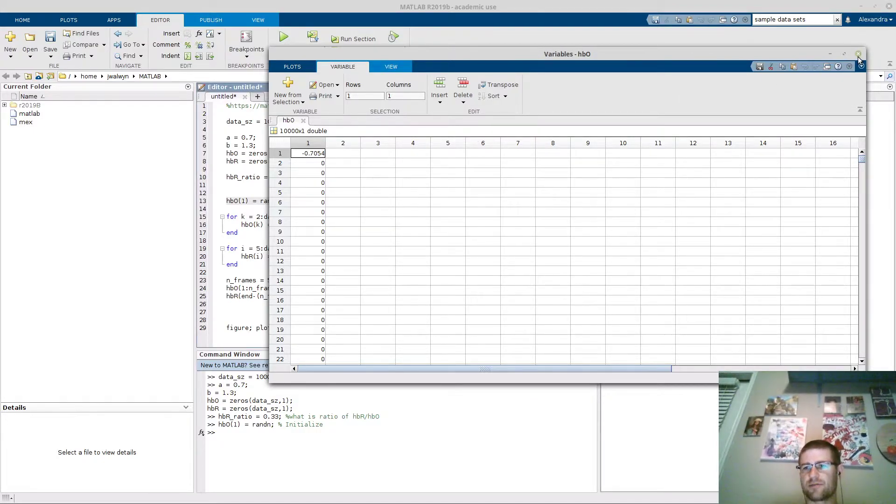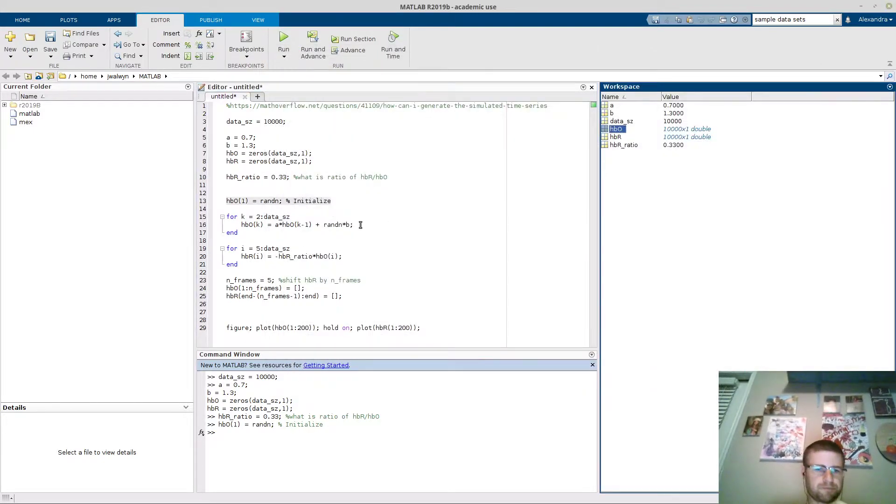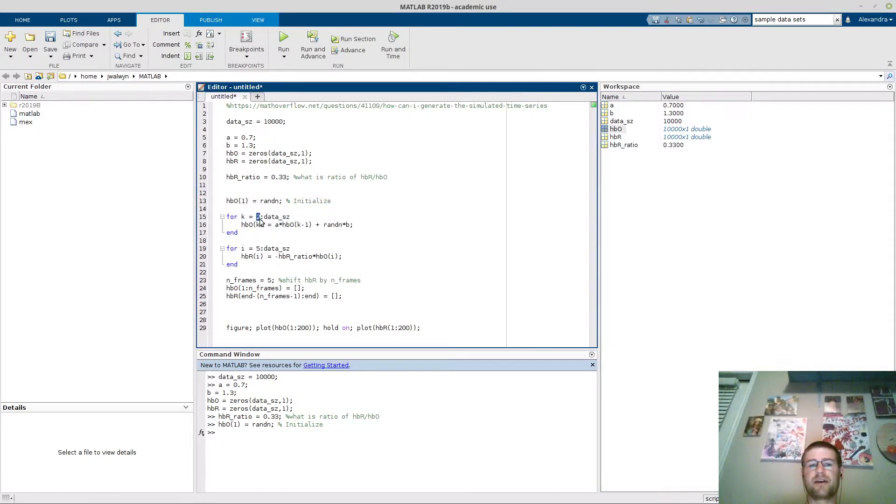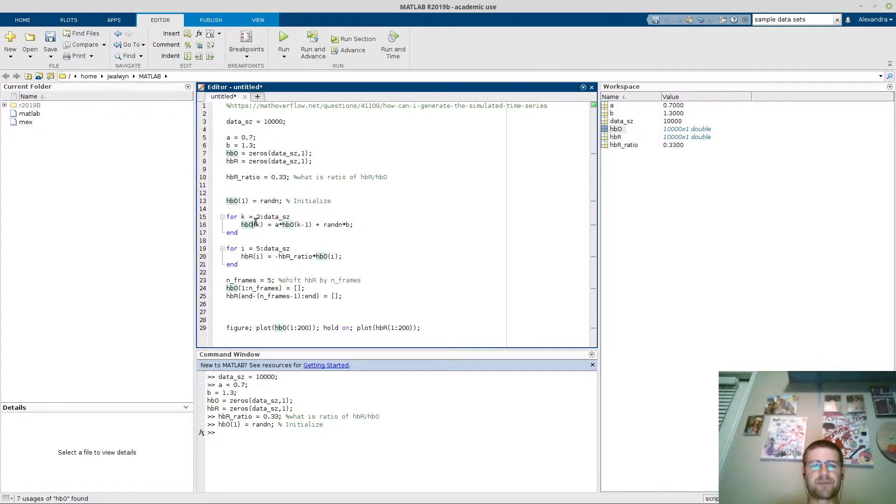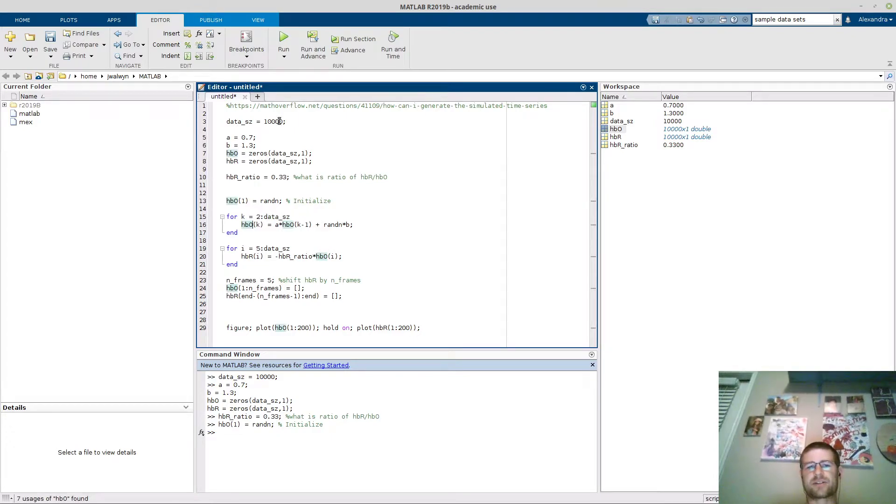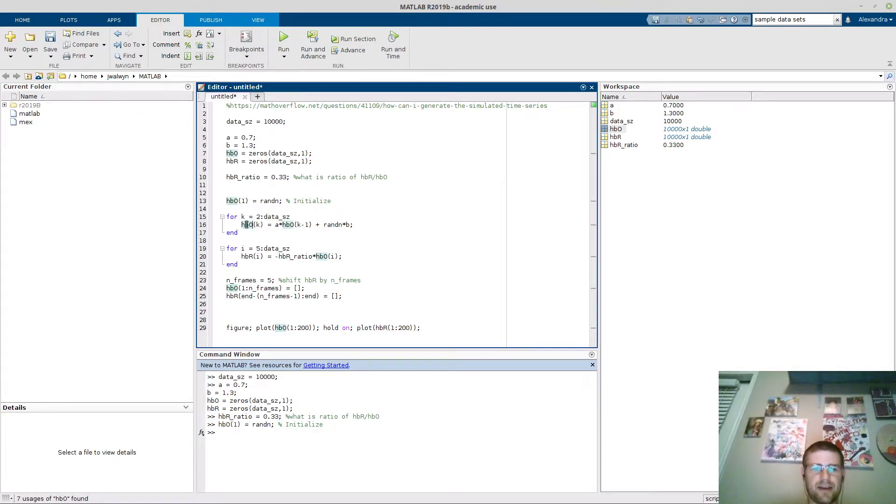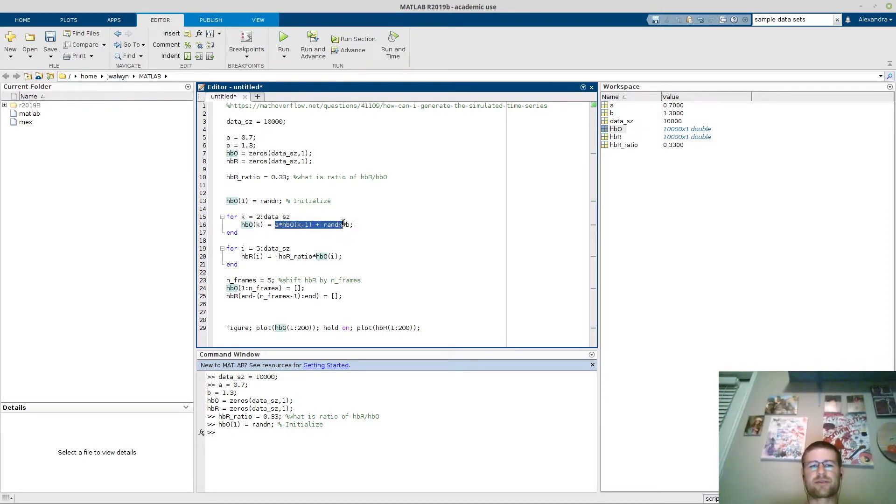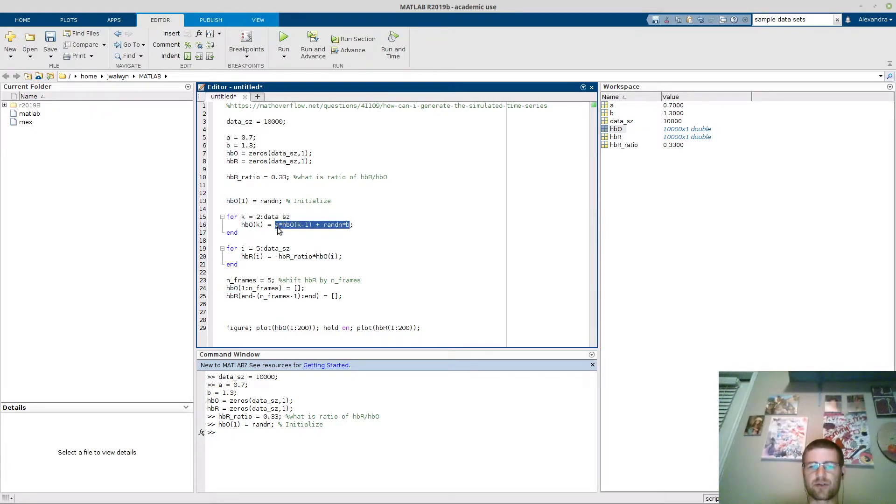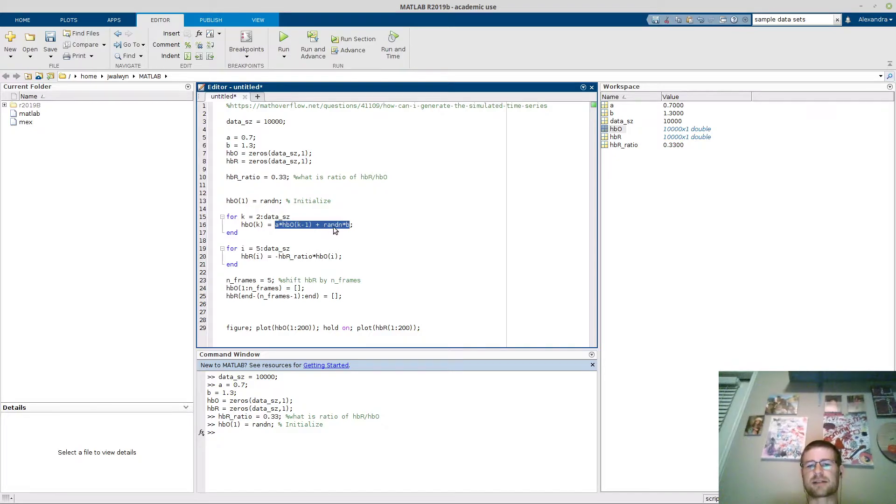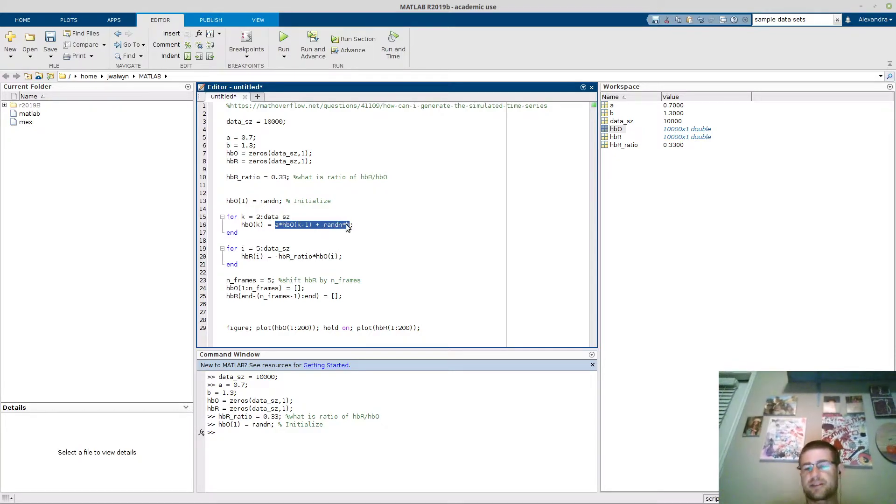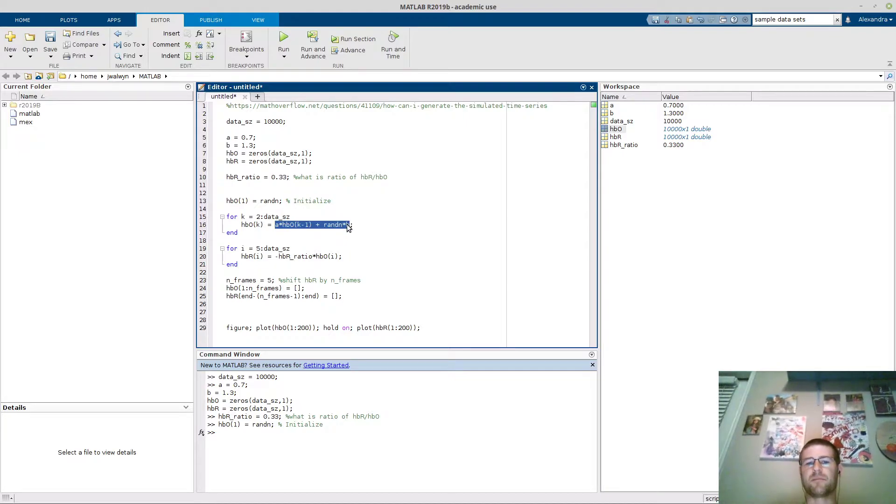Then I'm actually going to perform a loop. The loop is going to go from the second frame because I've already initialized the first frame, and it's going to go all the way to the end, which is data size set to 10,000. Then I'm going to set the points in the loop of HBO to this formula here. It's a smaller than one multiple of the previous time point plus whatever the random multiple is.